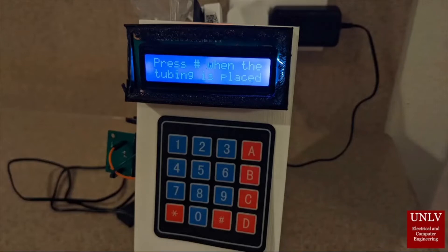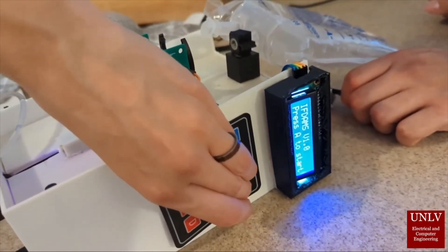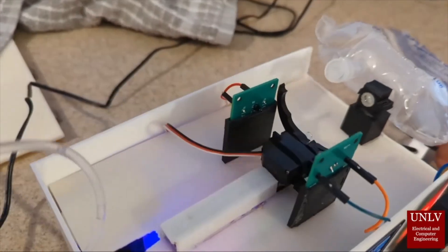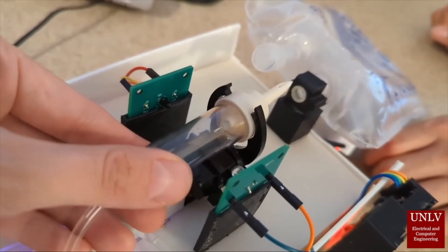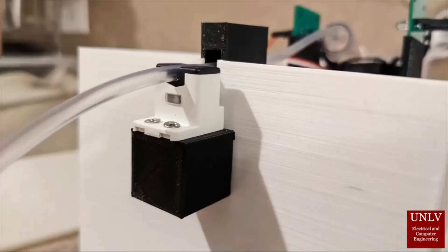This is our user interface with the nurse — the keypad and the LCD that comes with a series of different instructions. You can see that we put the tubing into the device; the motion it performed beforehand is a reset. From there it grabs the tubing and the nurse is able to input different actions.